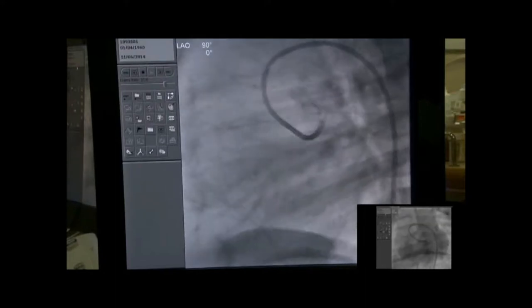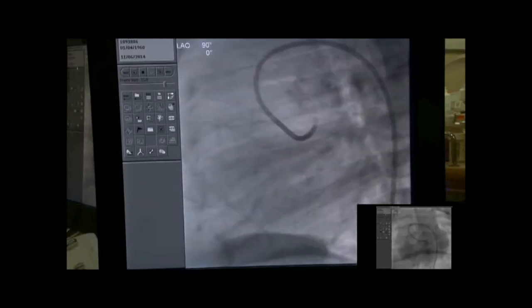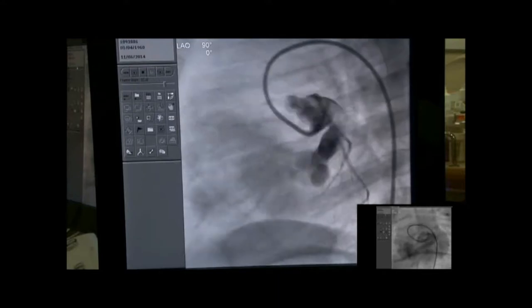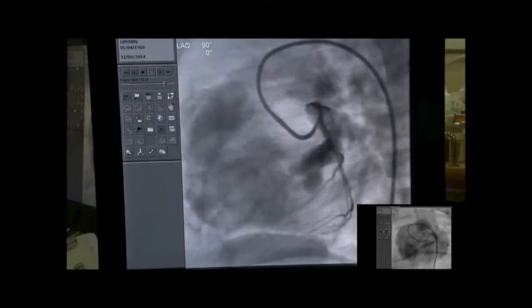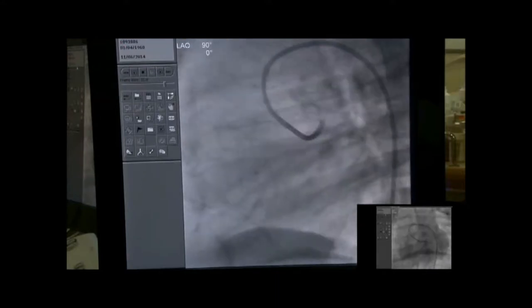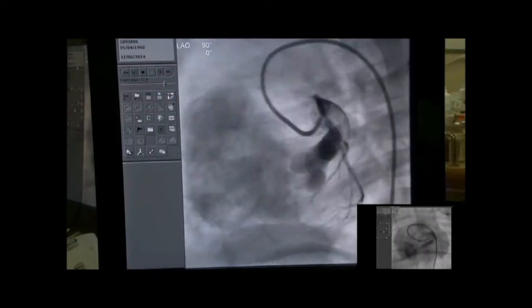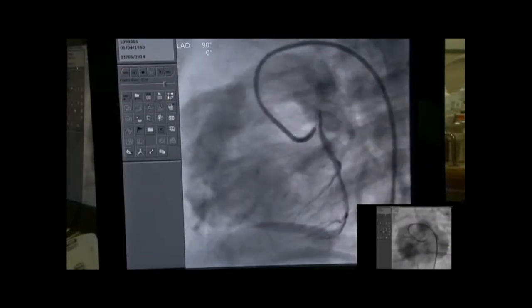Do you see that? Yeah. It's Joe here. I think you had a ghost of the left anterior descending in the previous injection. Further back. So this is a true fistula rather than part of the coronary artery itself. Yeah, correct.